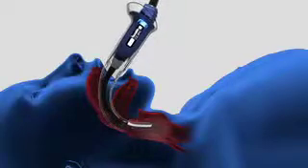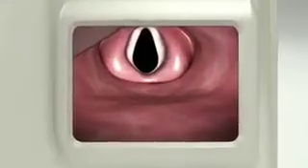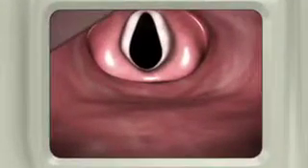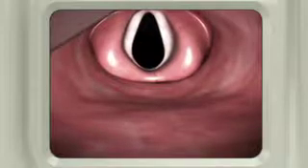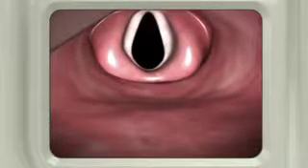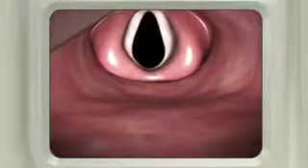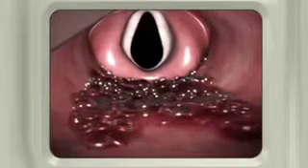When the Glidescope videolaryngoscope is appropriately positioned, the glottic aperture is centered in the upper third of the video display. This optimal view in the display is achieved using minimal lift force, only 2 to 3 pounds. This provides a wider view and more working space for intubation, while the camera position further reduces the effect on the view from blood and secretions in the airway.